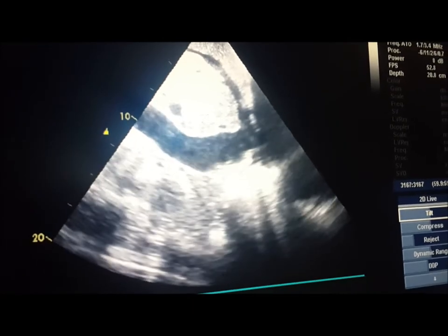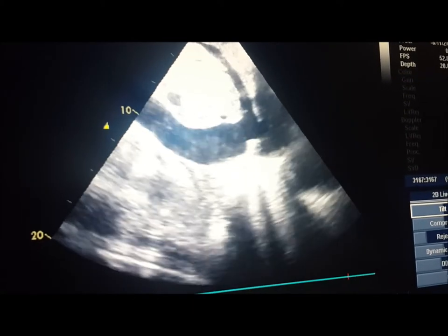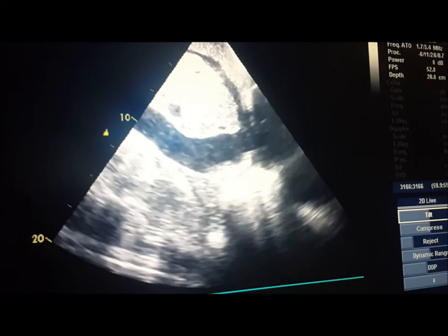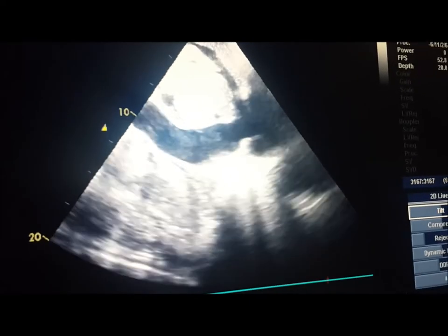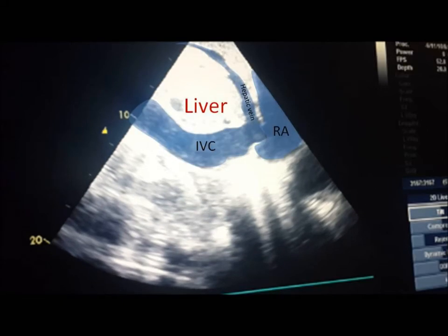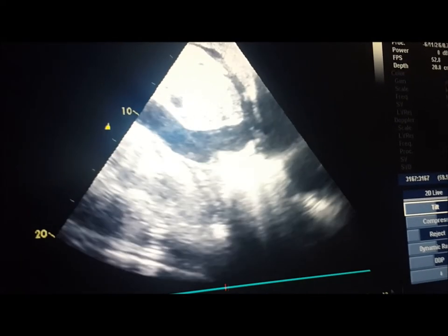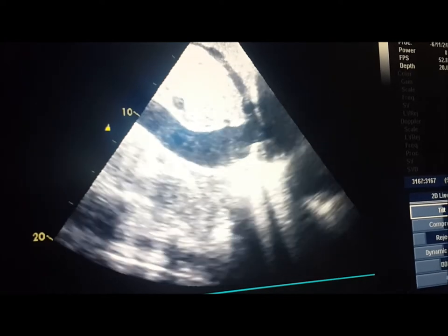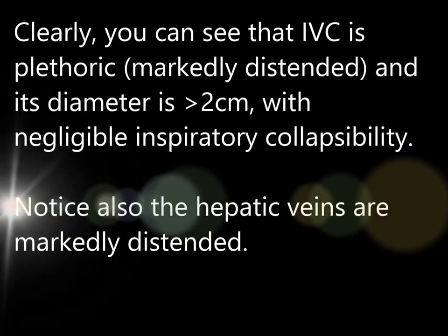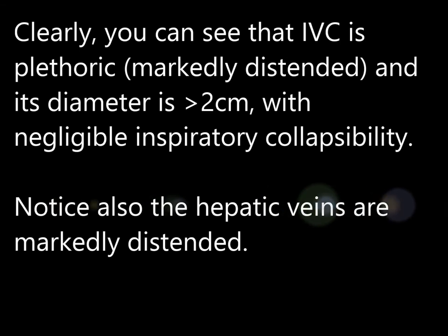And here we go. You can identify the IVC as a tubular structure as it inserts into the right atrium. Here is a labeled image. One of the hepatic veins is also seen clearly as it inserts into the IVC. Clearly you can see that the IVC is plethoric and its diameter is more than 2 cm with minimal inspiratory collapsibility. Notice also that the hepatic veins are markedly distended.